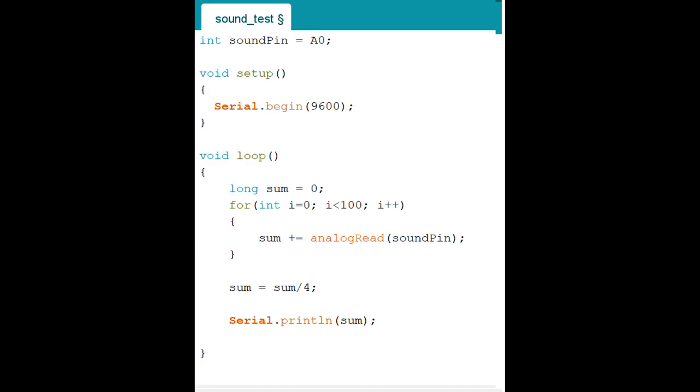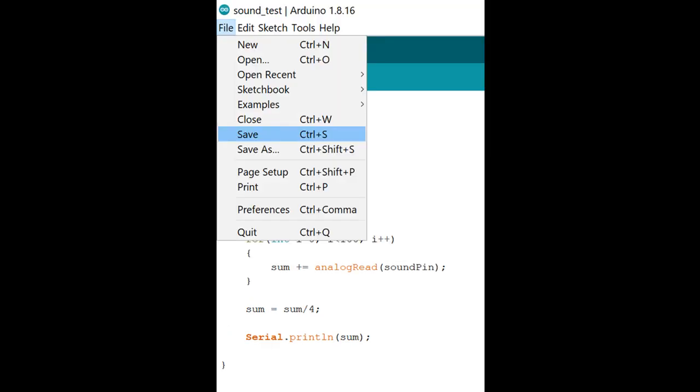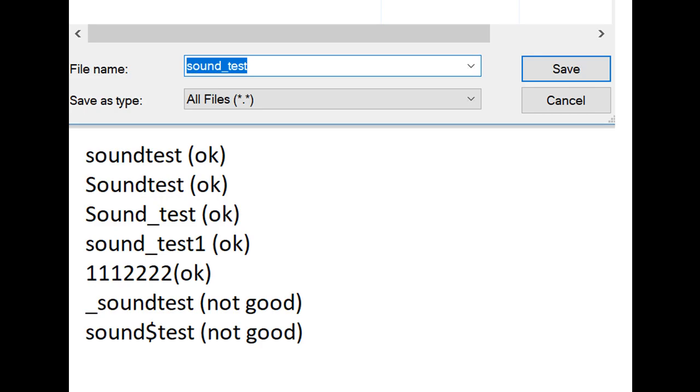So first thing, I would like to emphasize that it's a great habit to save your file even before you do anything, because you don't want to lose your work after you put certain amount of time and effort. So what I would do is saving file. So I go to file on the menu on the top of your Arduino tab, and then go to save, and then you can name whatever you want. I named sound test, but you can name whatever you want.